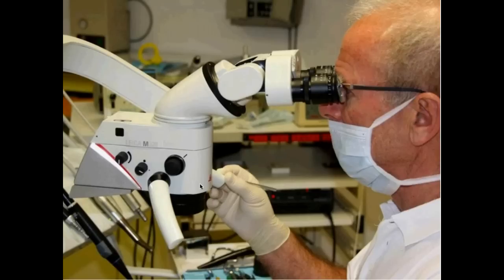Okay. And in those pictures in your presentations, you're wearing glasses. Do you have to wear these glasses with the microscope? And what about presbyopia glasses? Do you need to use them when working with the microscope? Well, I'm using presbyopia glasses, but you don't have to. You can always adjust the ocular so that you can work without glasses. But when there's more than one doctor in the office, it's better to work with glasses and to have a neutral position of the adjustment of the ocular or the eyepiece.